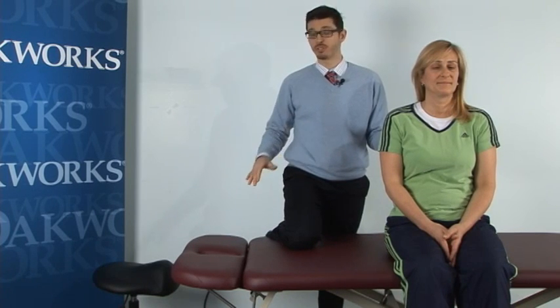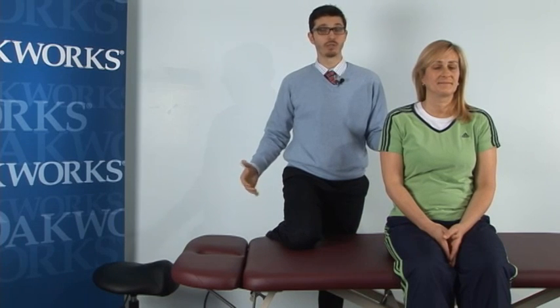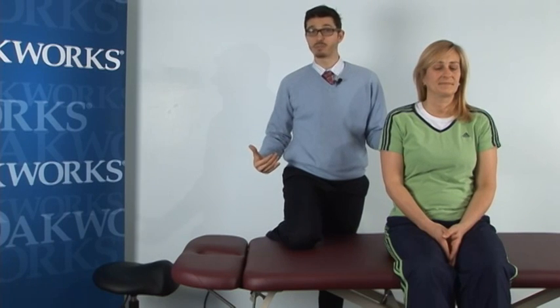The next piece that we're going to look at is passive physiologic, and we're going to show you how to use the table to find the right area and ergonomically set yourself up so that you're able to reproduce a good assessment and employ a treatment technique with ease upon using some of Oakworks products. The third area is the accessory joint mobility assessment. That's where you can just transition right into treatment rather quickly.